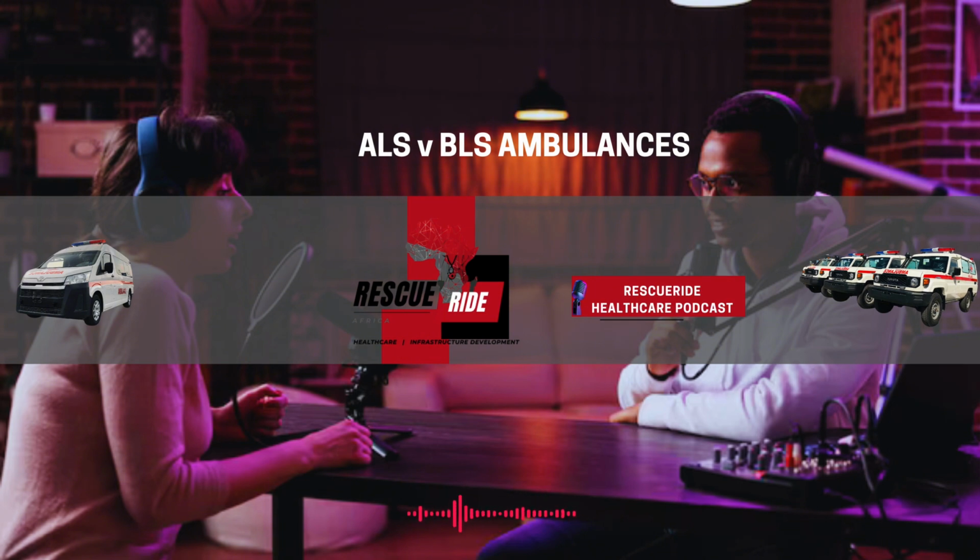Absolutely. So for those tricky situations, ALS ambulances carry something called intraosseous needles. It sounds a little intimidating, but they're really incredible life-saving tools. So what are those used for? Well, in some emergencies, like severe dehydration or shock, finding a vein for an IV can be near impossible. So these needles allow paramedics to deliver fluids and medications directly into the bone marrow. Into the bone marrow. Yep, and from there, it quickly enters the bloodstream.